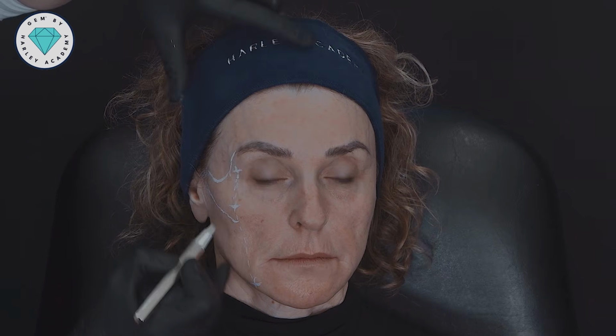The second thing we need to do is understand where the apex of the cheek is, the most projected part, which is not an anatomical structure, it's more of an aesthetic structure. And a good way to identify that is to find this midpoint between the zygomatic bone, the midpoint between the orbital bone laterally and this vertical line downwards, that we've already got. We'll find a nice prominent aspect that we want to create some projection at. So this was where I would say the cheek apex is.